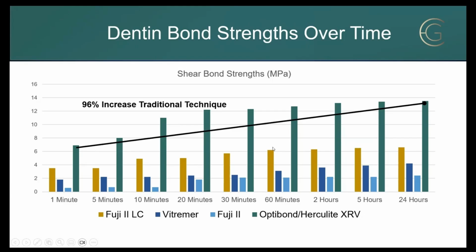At 20 minutes, in chairside dentistry at 60, you're going to have an 80% increase over the traditional method. At 24 hours, it's a 96% increase. So you really want to let the bond mature. No way are any of us going to place our bonding agent and then say, okay, Mrs. Smith, we'll see you tomorrow, 24 hours, and I'll finish the filling. We'd all go bankrupt, or we'd be mental over that. So we're not going to do that.